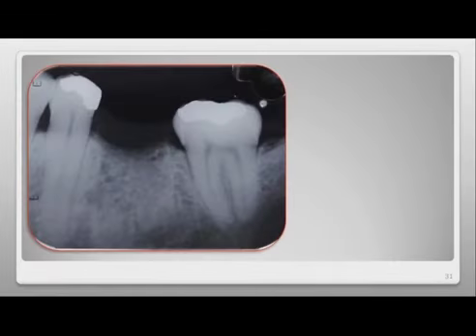In this X-ray image, we can observe the site immediately after the procedure. As we can see, the tricalcium phosphate granules completely fill the post-extraction alveolus. We can see the cortical areas of this bone. We could still call the alveolar bone itself fascicle bone that has not been reabsorbed. We can also see that the alveolus is completely filled with material.